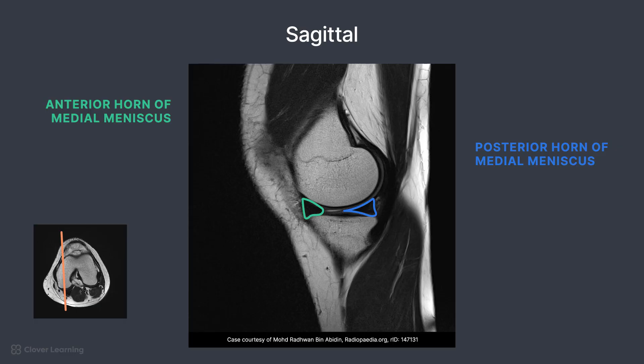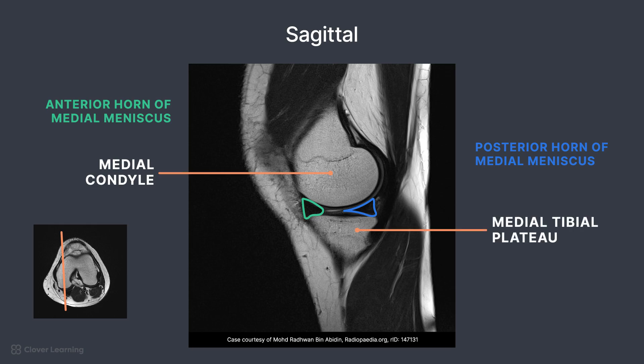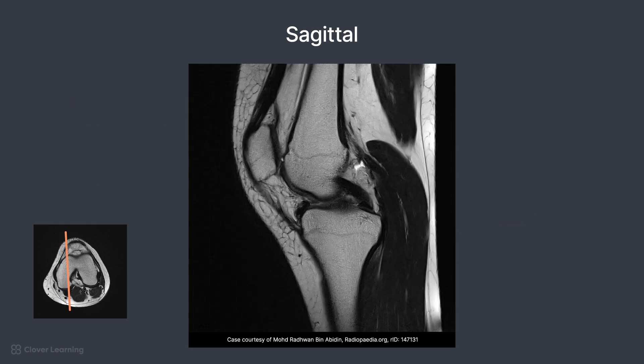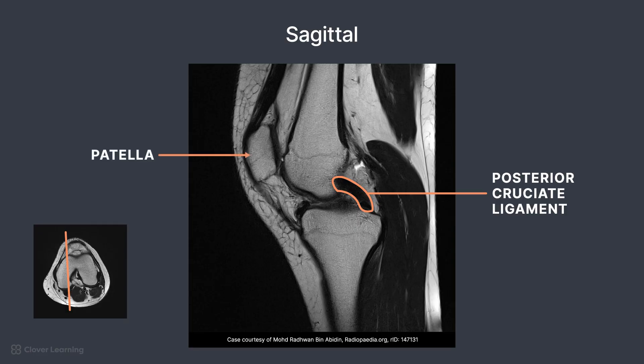These are sometimes described as dark triangles. Superior to the meniscus is the medial condyle and inferior is the medial tibial plateau. Arriving toward midline, the posterior cruciate ligament is demonstrated — it usually looks like a curved structure. The patella is demonstrated, with articular cartilage located on the posterior aspect to reduce friction in the joint.